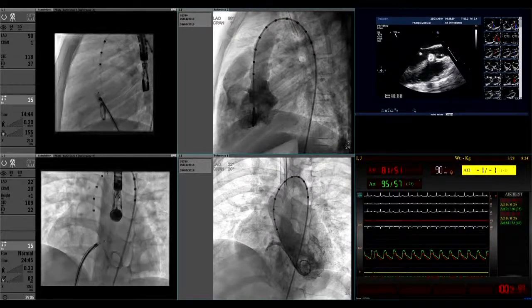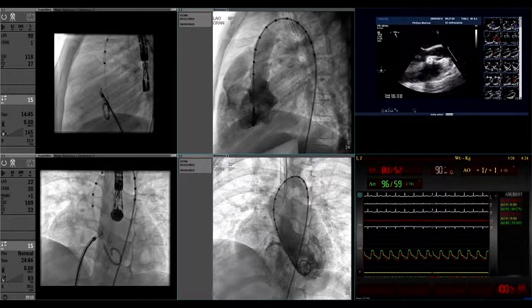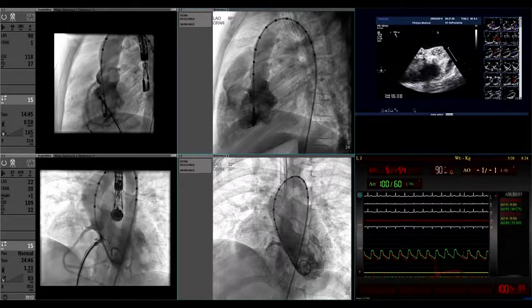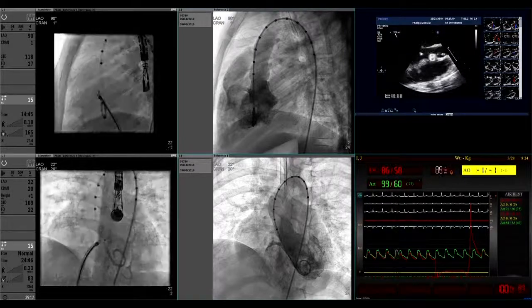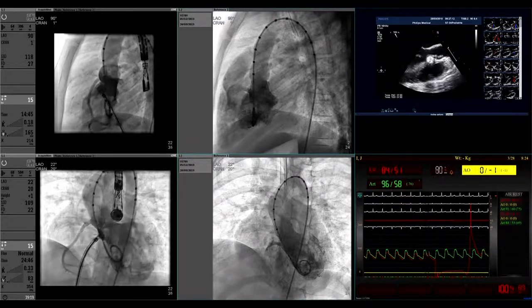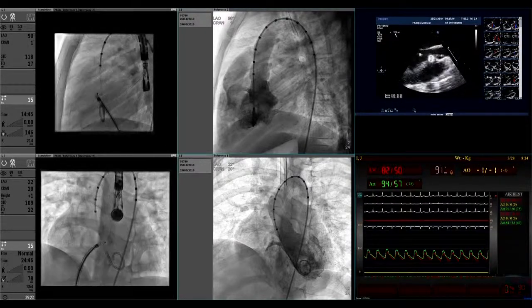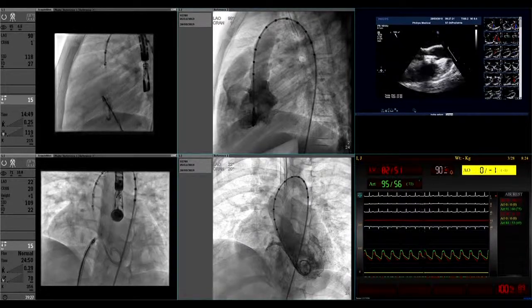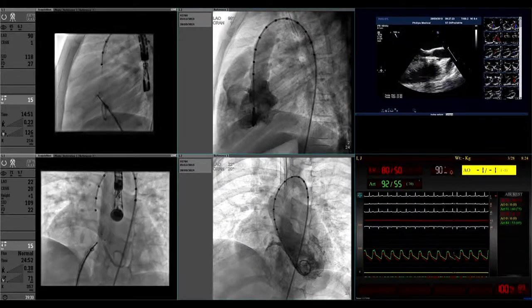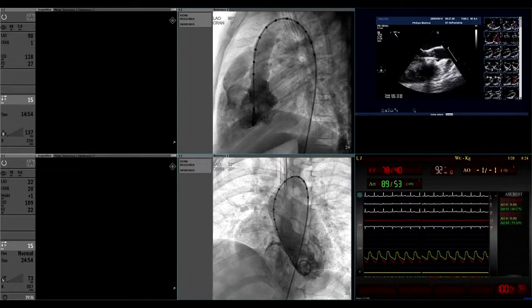Yeah, and now we do angio. Okay, you can see the angio now. And you see the left side, this looks very beautiful now. And what you do next, just deploy the remainder. Okay, I deploy the remainder, and I hold the cable and put back the sheath, and everything I think is okay. And now you can do angio, the second one.